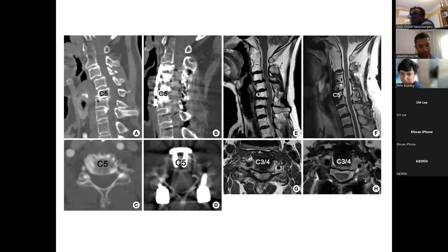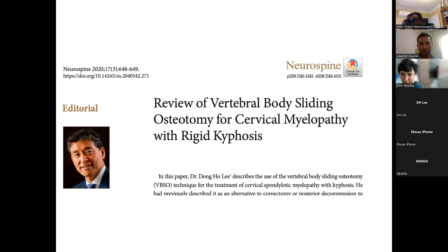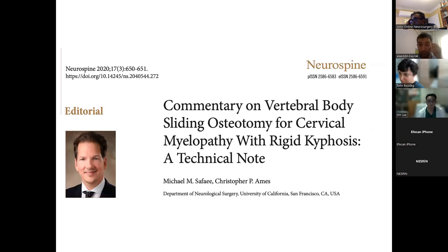If you take a look at pre and post-op CT and MR images, you can see the appropriate canal widening as well as complete correction of staircase kyphotic deformity. Solid bone union was achieved at post-op 1 year. Thankfully, two well-known American spine surgeons, Dr. Dan Liu in Columbia University and Dr. Chris Ames in UCSF made a warm commentary on this paper. I really appreciate it.